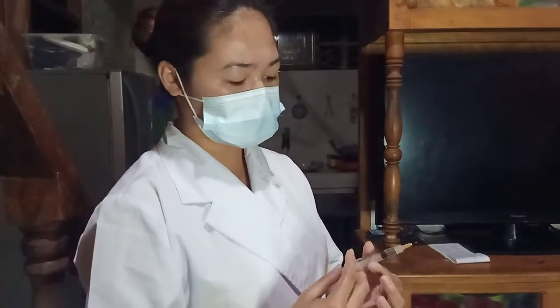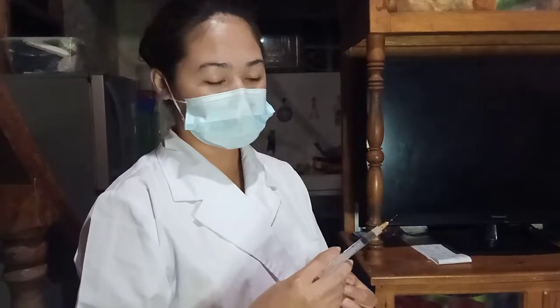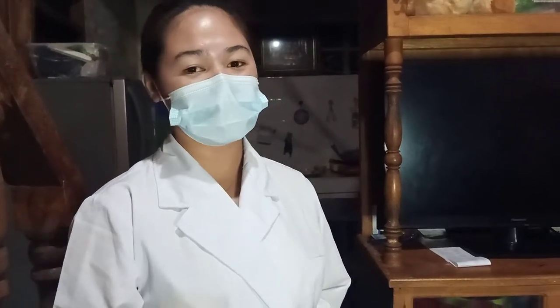So there are no bubbles. And replace it with the gauge 25 needle that we use for the intramuscular injection.